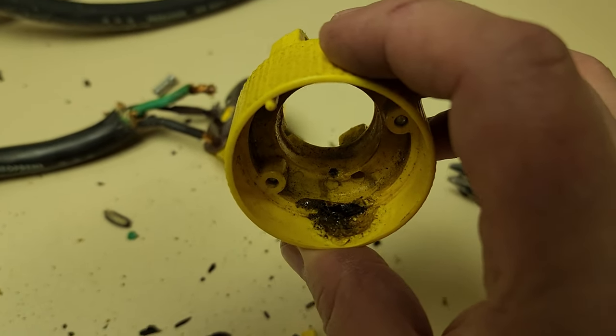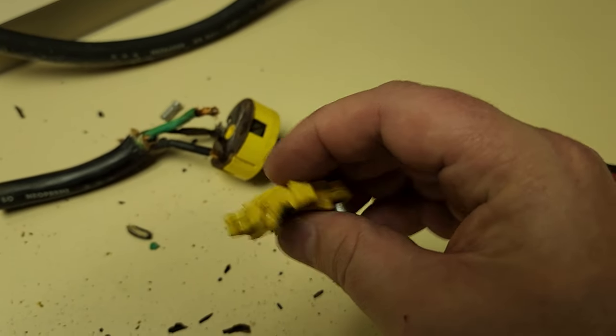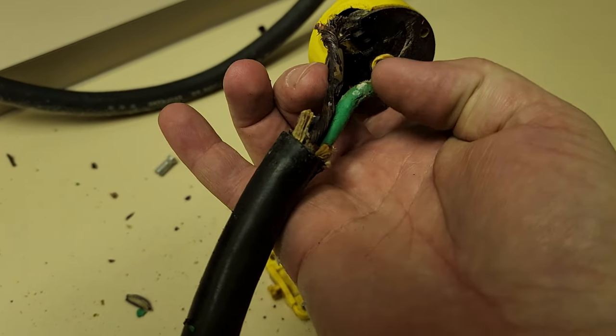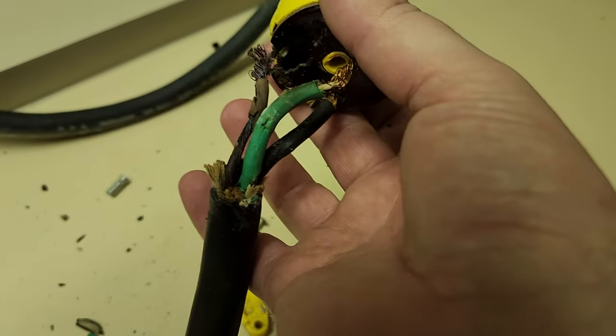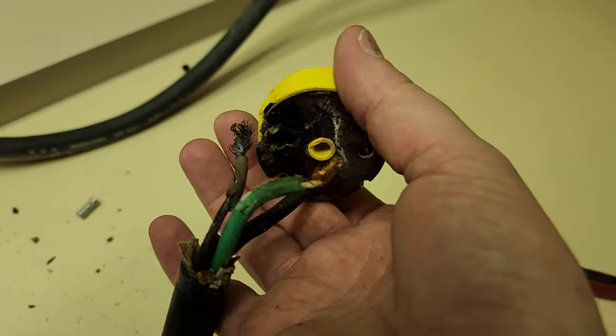Look at this, inside this guy here. You can see that the wires, they got really hot. It's completely bound up and melted to the plastic. And this is all that I could see coming out of the strain relief right here, so you can see my L1, L2, and ground. Ground is okay, but L1, L2, those guys got hot, hot, hot, hot.